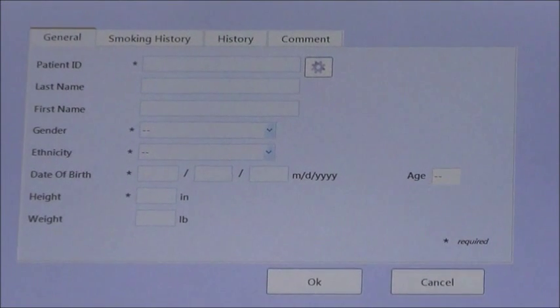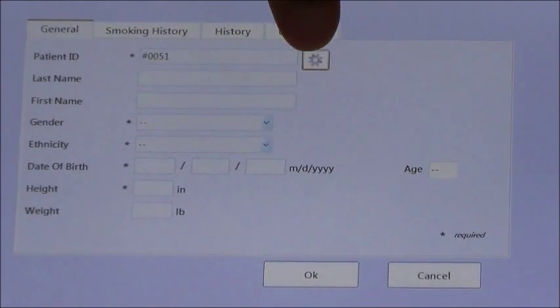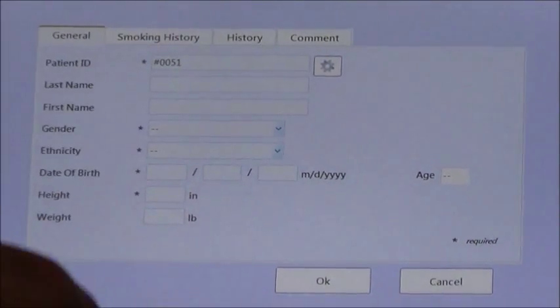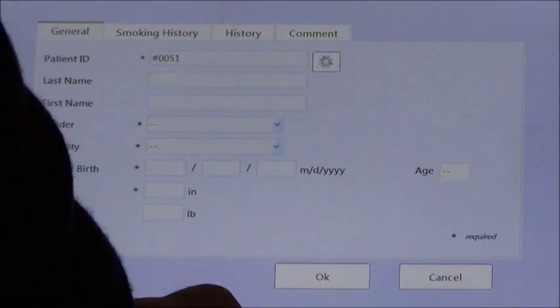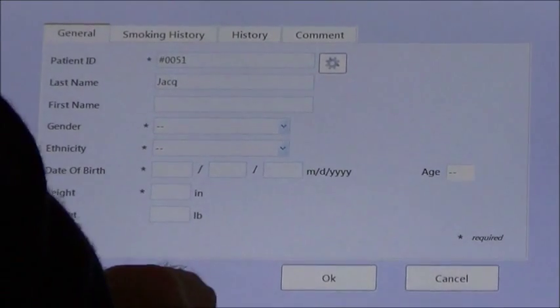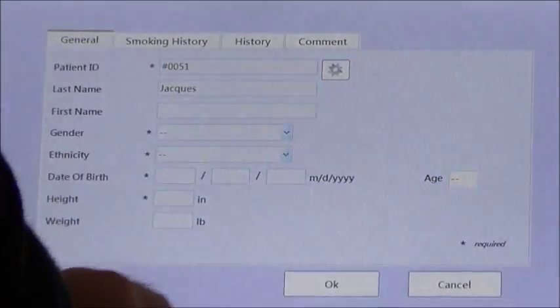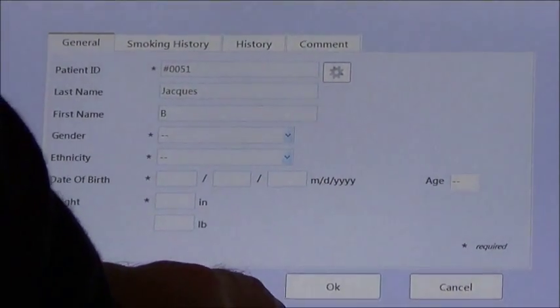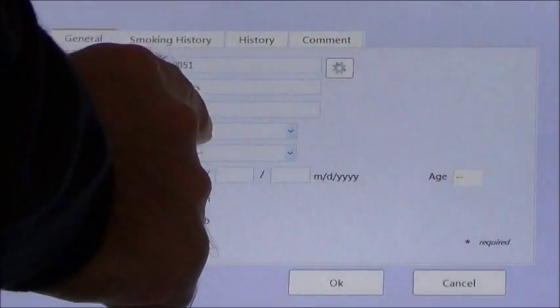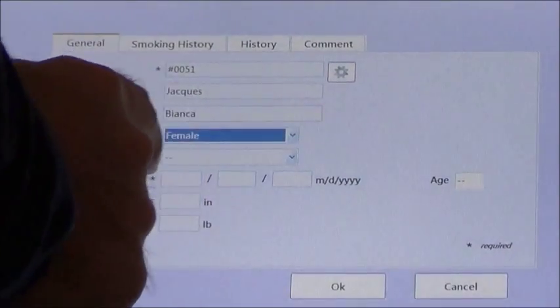From here, you enter the patient information beginning with patient ID. The device will automatically assign an ID number if you like, or you could enter any number you like. Name is optional, but we will enter Bianca's information here. The gender, ethnicity, date of birth, and height are all very critical — they need to be entered correctly.